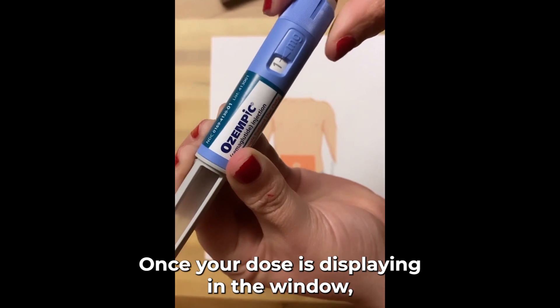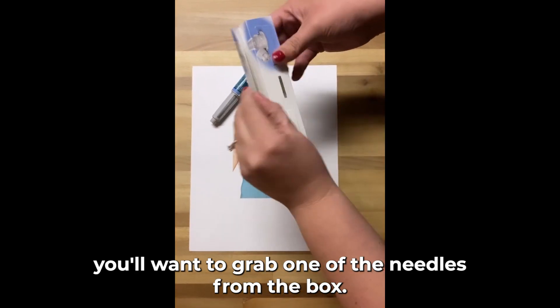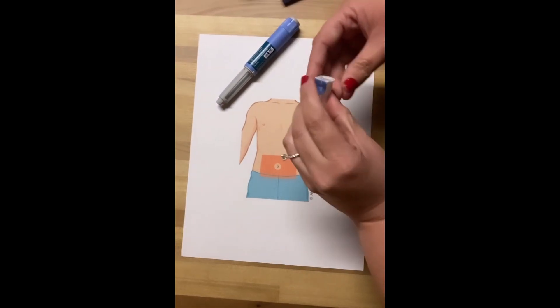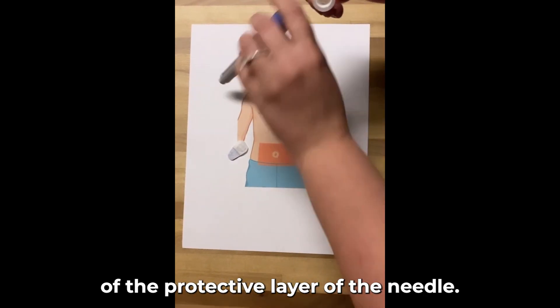Once your dose is displaying in the window, you'll want to grab one of the needles from the box. You'll remove the tab from the top of the protective layer of the needle.